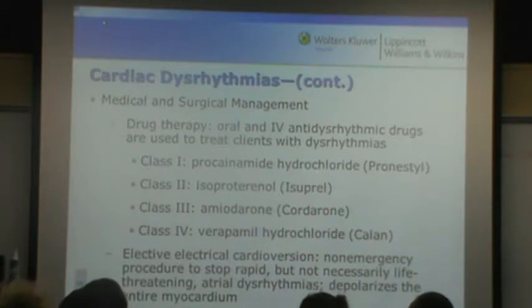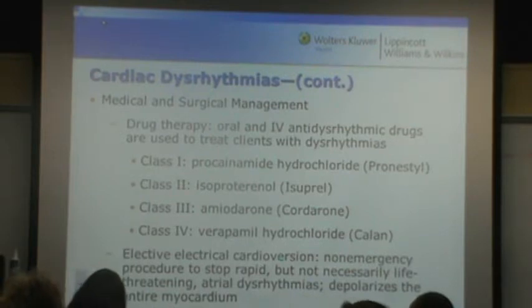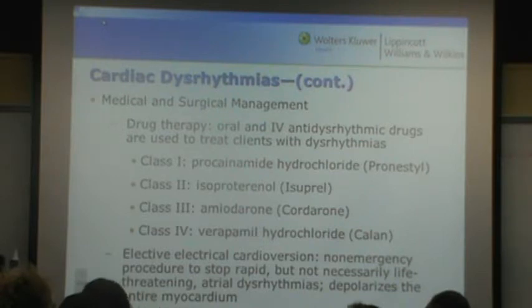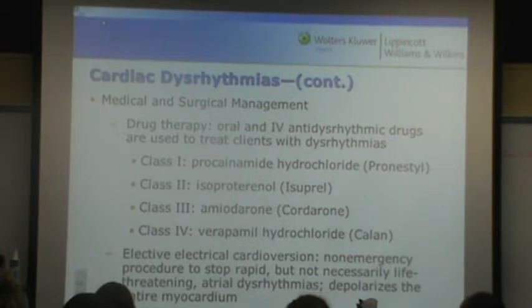What's neat is, when we get ready to deliver the shock and push the shock button, it's not like regular defibrillation, where defibrillation is immediate, just boom. With synchronized cardioversion, it will wait just a second and then deliver that shock at a very specific point in time in the cardiac cycle. With electrical cardioversion, we're also using less energy. It doesn't take as much energy as regular defibrillation does.